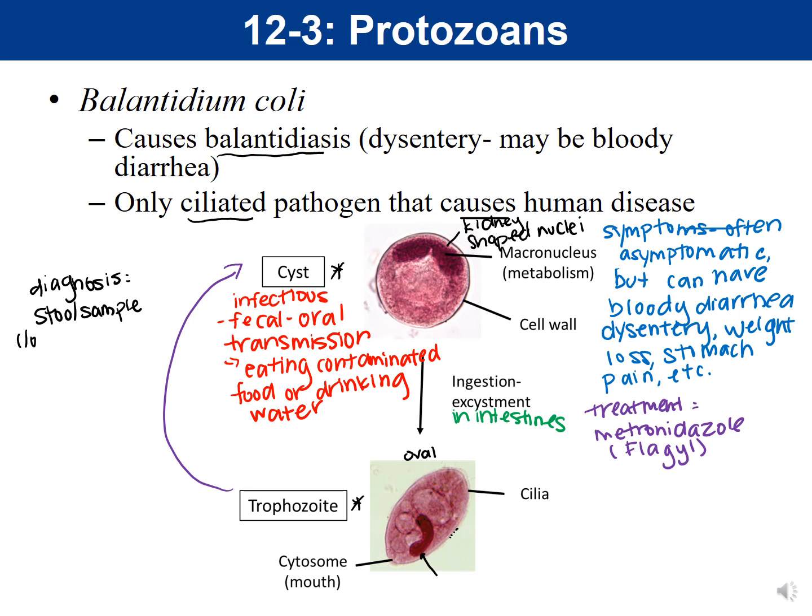So looking for trophs or cysts in stool sample. So again, method of diagnosis is going to be a stool sample.